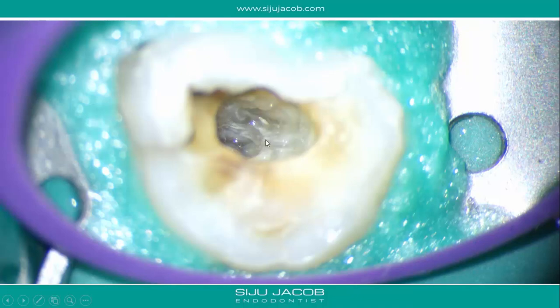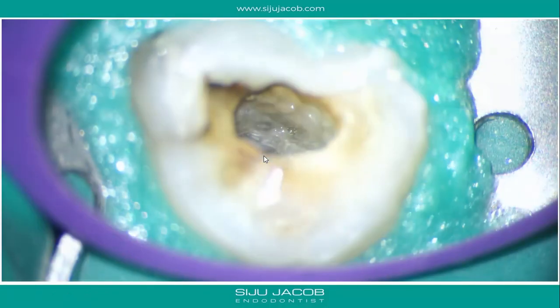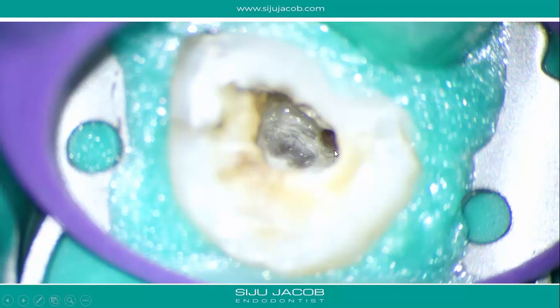I drilled through that area and found a K-file catch — what seemed to be a canal. We cleaned the area up and sure enough there was a canal there. By this point almost an hour had passed, so once you locate one canal the next job is to figure out whether there are additional canals or if it's just the one.